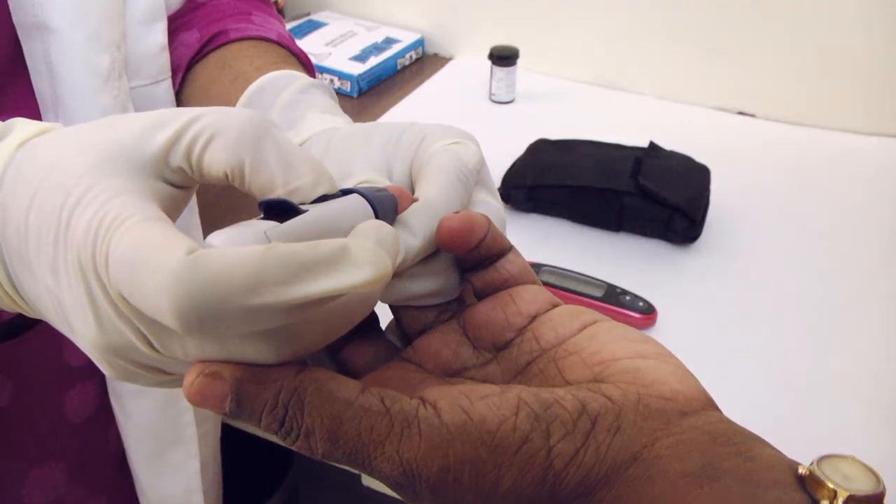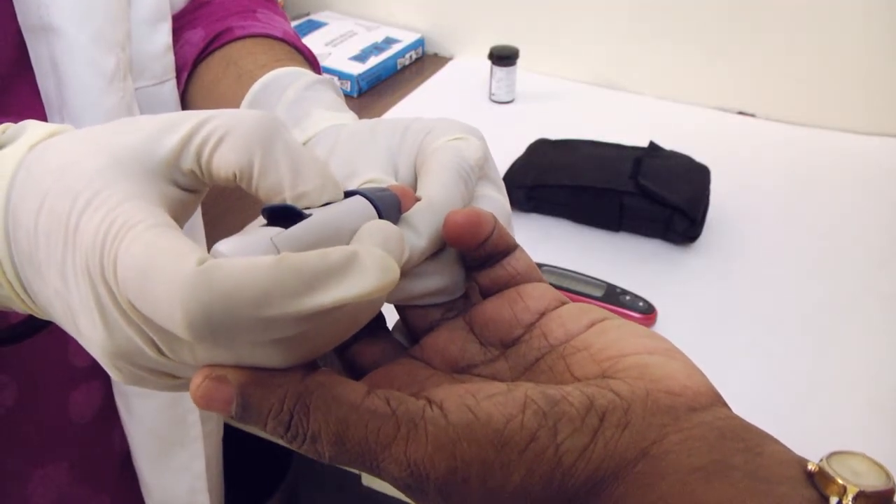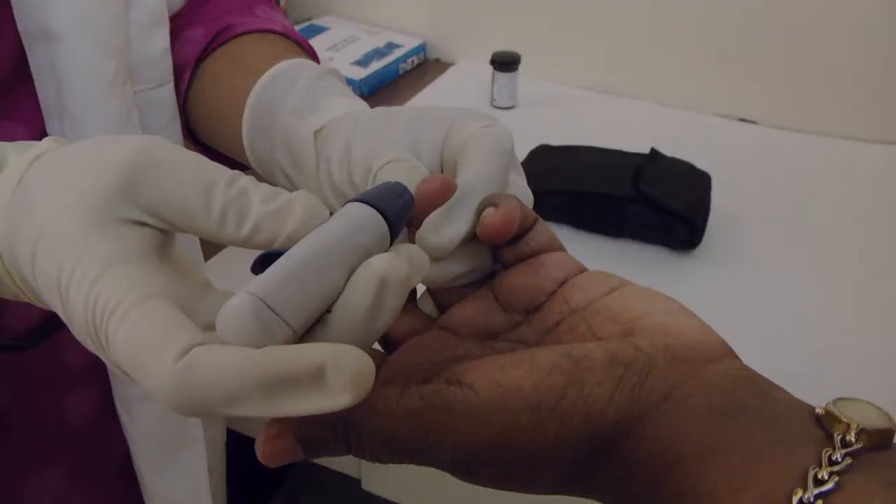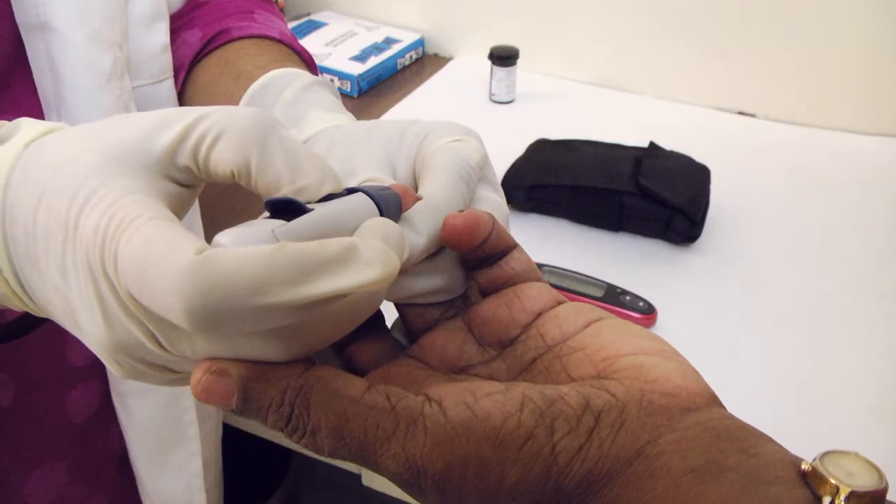Slide the control button back on the lancing device until it clicks. If it does not click, the control button may have already been locked back and ready to spring for the puncture when you inserted the lancet. Hold the lancing device firmly against the side of the finger. Press the release button.